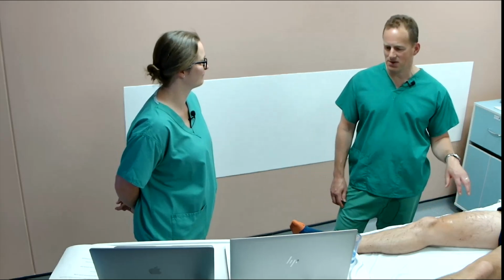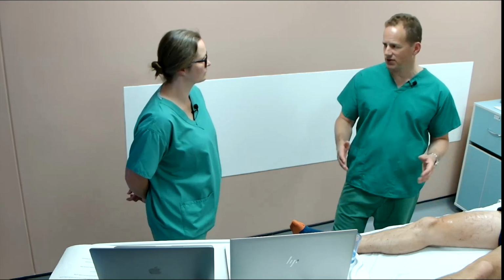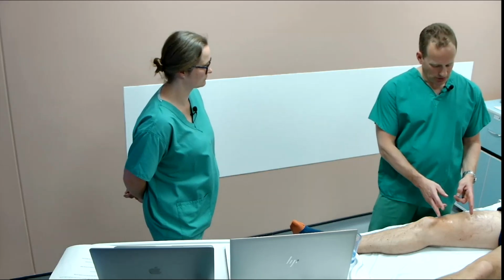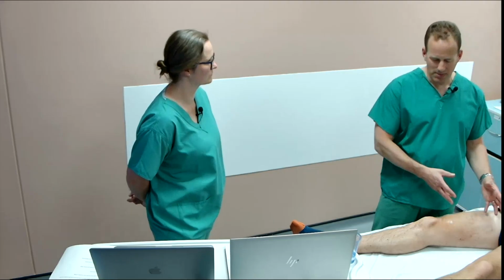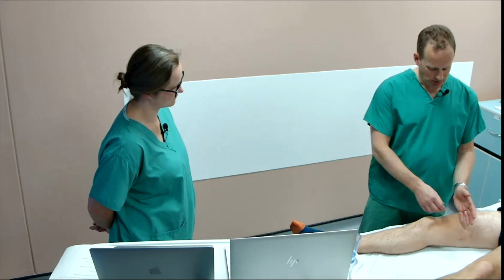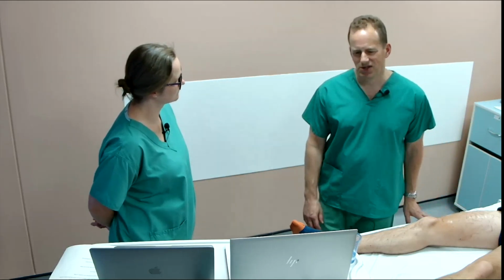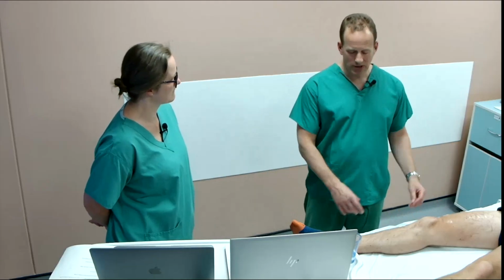And to get them to stay in place, I think it's much more of an advanced level skill, and it's difficult to do pre-op, because you've got to work out where you're going to leave it. The surgeon's going to put a tourniquet on the leg, and it maybe gets shifted, and afterwards you've got a dressing here, so you've got to peel back the edges of the bandage and things. So it's just the logistics of it all, and I don't think it's really warranted. I think it's good enough without.